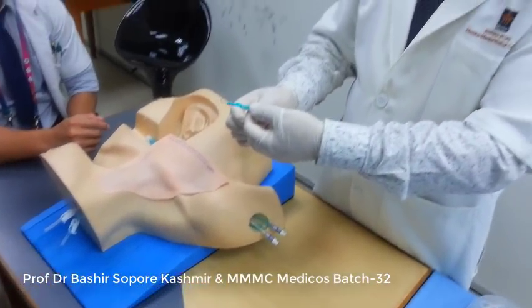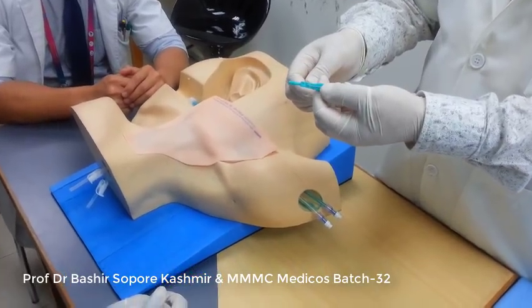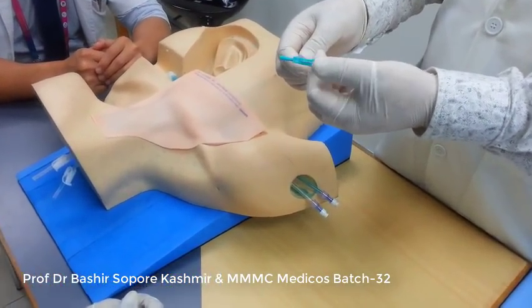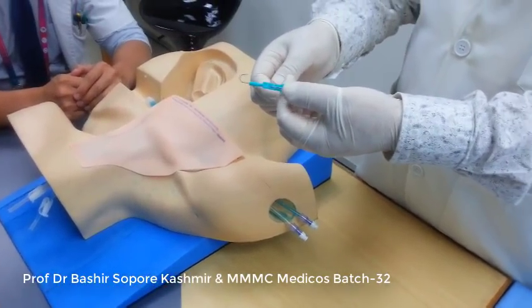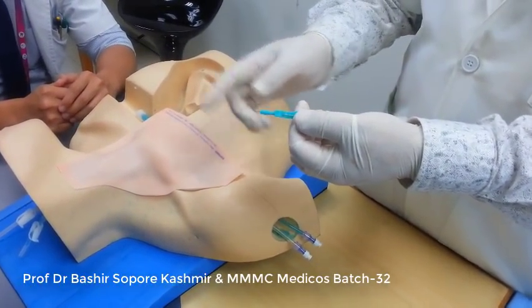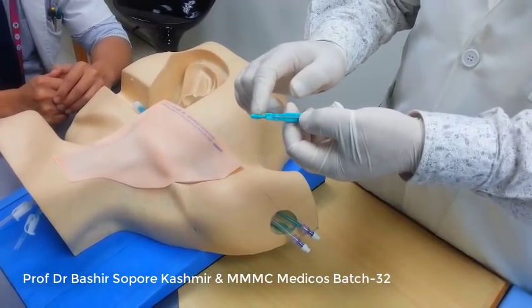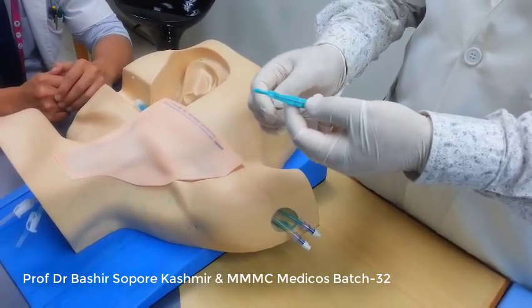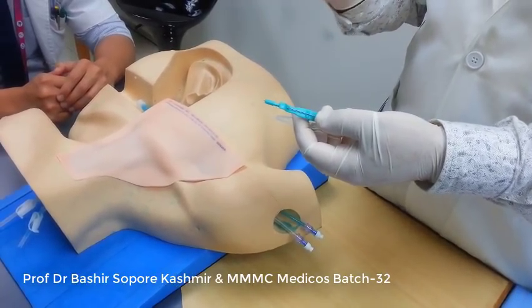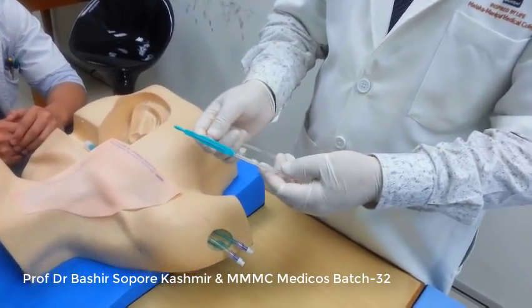So if you hold back this guide wire like this, it becomes straight. You see, it becomes straight. If I move it forward, it becomes curved like this. So when you are trying to introduce this into the needle, you first straighten it. This part is a straightener, which is called a straightener sleeve. You understand my point?